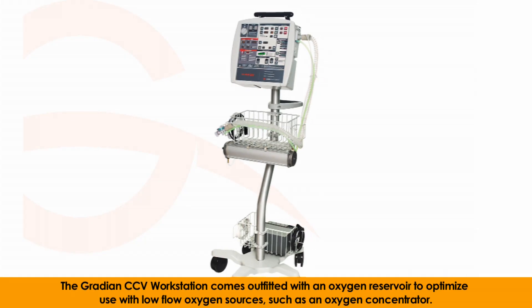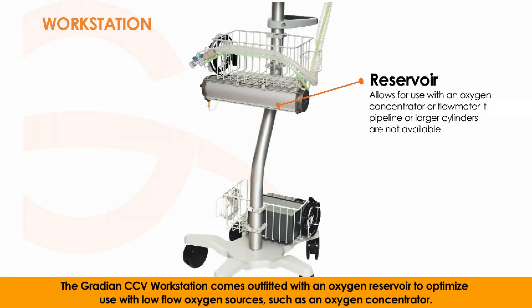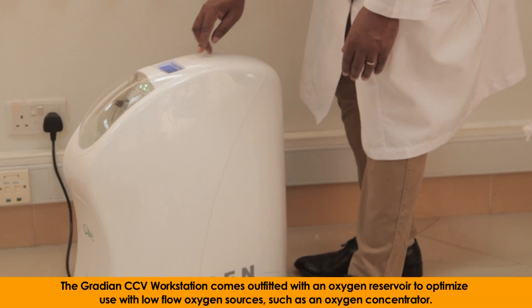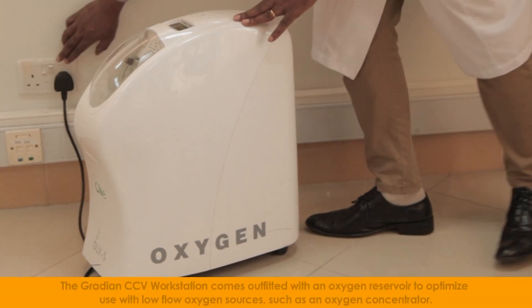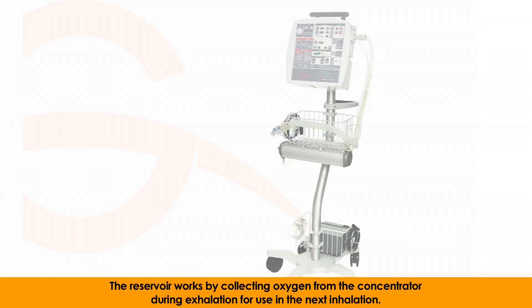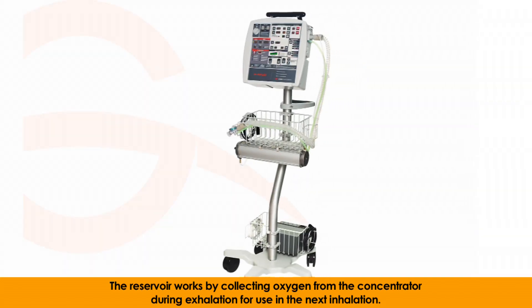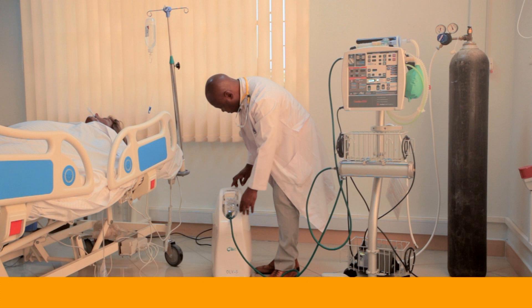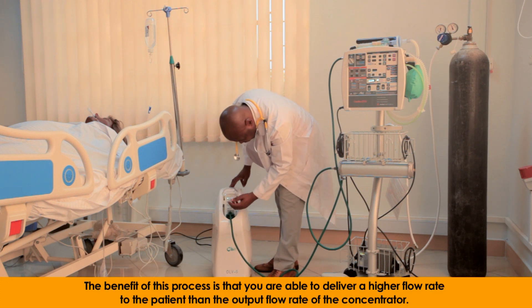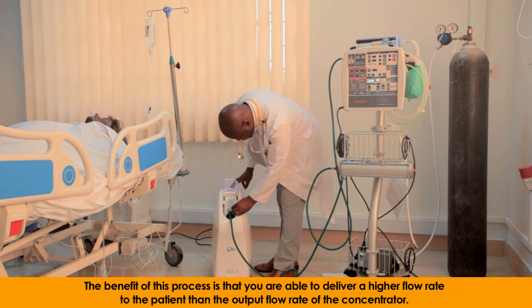The Gradient CCV workstation comes outfitted with an oxygen reservoir to optimize use with low-flow oxygen sources, such as an oxygen concentrator. The reservoir works by collecting oxygen from the concentrator during exhalation for use in the next inhalation. The benefit of this process is that you are able to deliver a higher flow rate to the patient than the output flow rate of the concentrator.